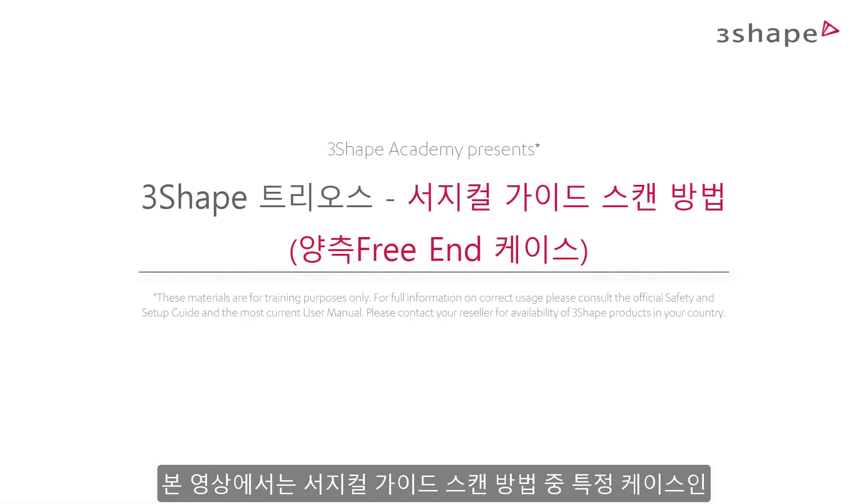Welcome to this How To Scan for Surgical Guides series, where we will explain how to scan for a particular case.